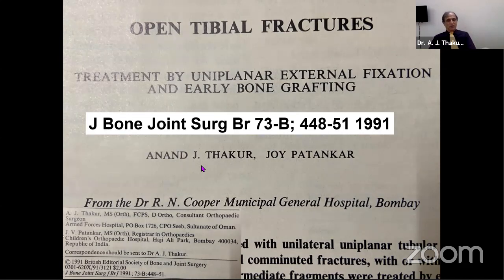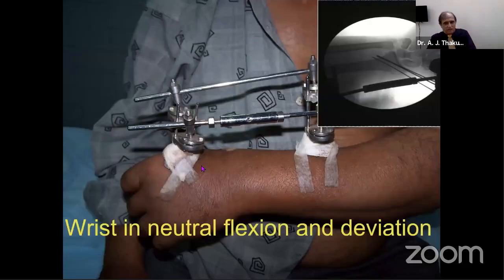So it is possible. There are issues. There were about 27% skin infections, and 40% had early bone grafting, but that was the topic. So 40% people had bone grafting there, but it could be treated. These patients had first and last treatment in external fixation. It could be done. However, in radius, it is still valid, and we are doing it day in, day out.